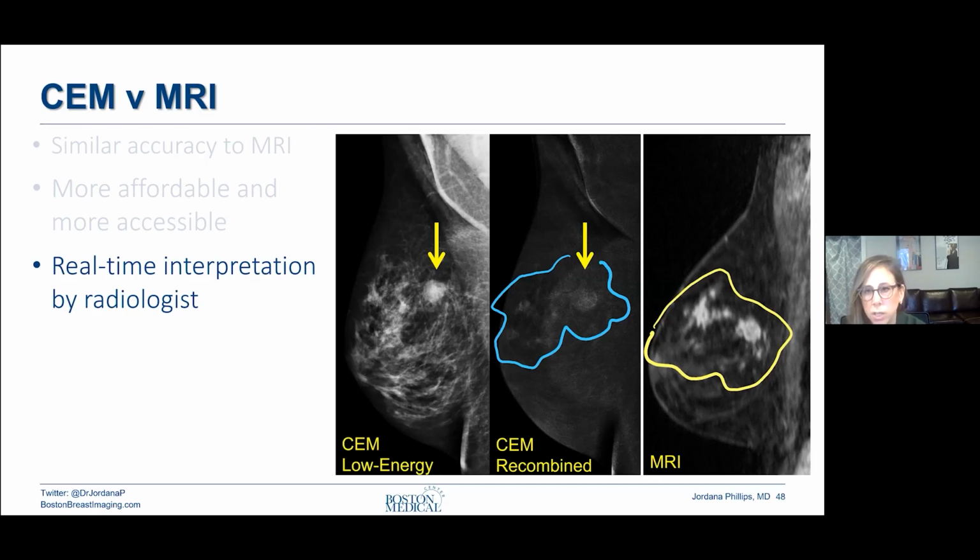The number of times that I've done these exams and have shown the patients the images, have shown them when they're totally negative in a patient who has dense breast tissue, is really comforting to these women to know that they can believe these results. Or similarly, in a patient where the contrast mammo is done for staging, I can say, no, don't worry. This area is isolated to this one small thing. You're good. The rest of your breasts are just fine. So this imaging modality allows us to maintain that communication with our patients, especially in this time where I think that communication and connection is important.